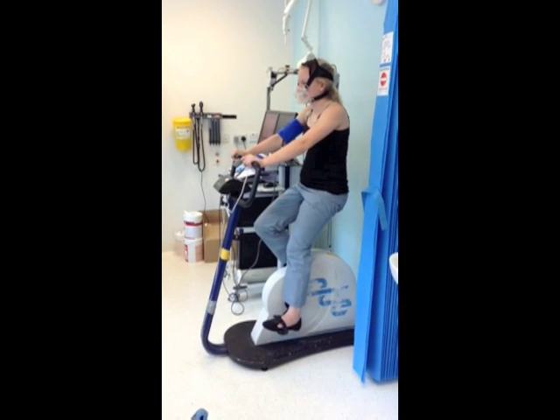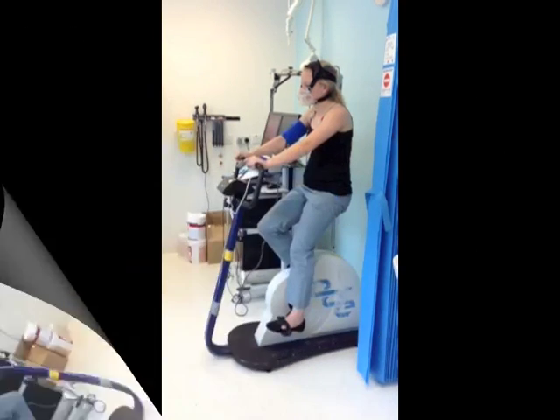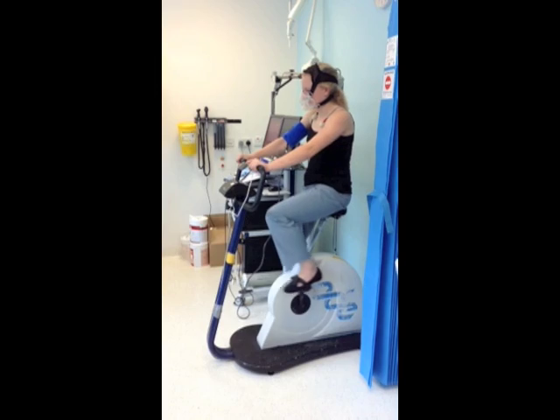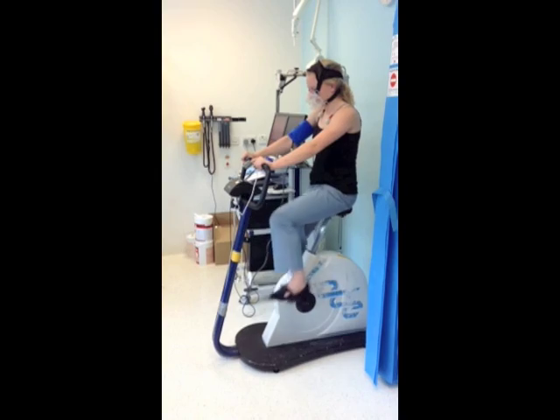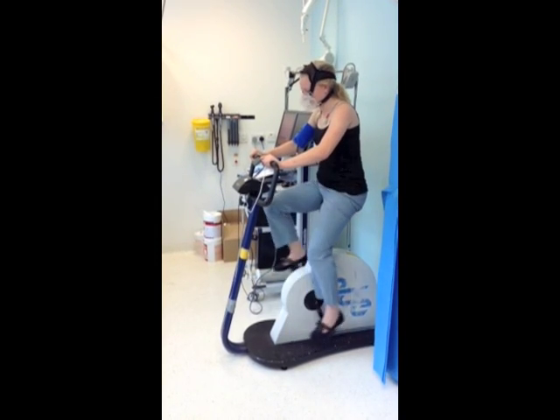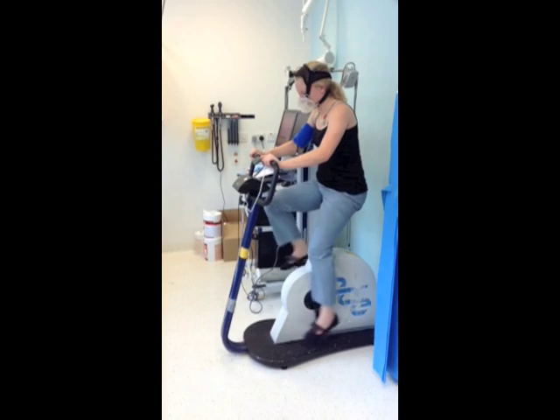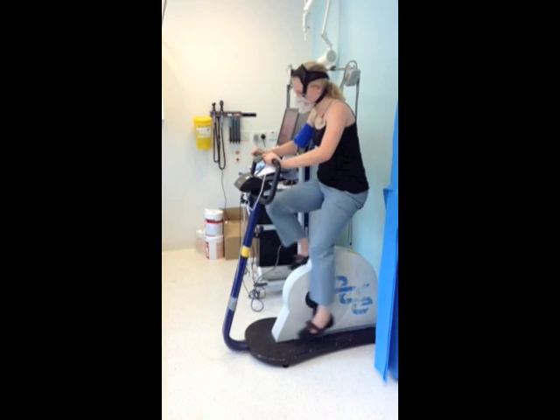The patient sits on the cycle ergometer for 3 minutes without cycling. Then the patient begins unloaded cycling, where there is no resistance on the bicycle. The patient should cycle at about 60 revolutions per minute. Soon, resistance will build on the bicycle at a preset rate, as if the patient is cycling up a hill, making the patient do work. The test aims for the patient to cycle up the hill for about 10 minutes.